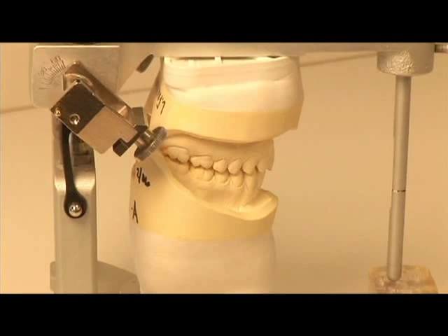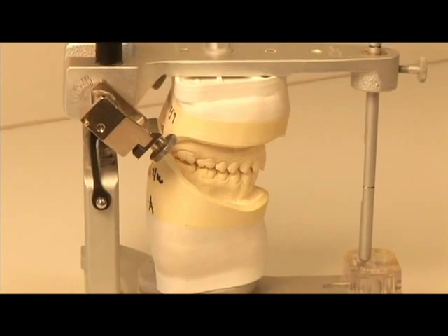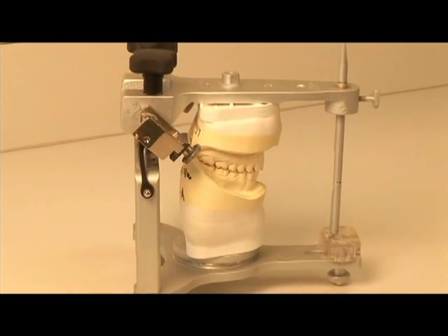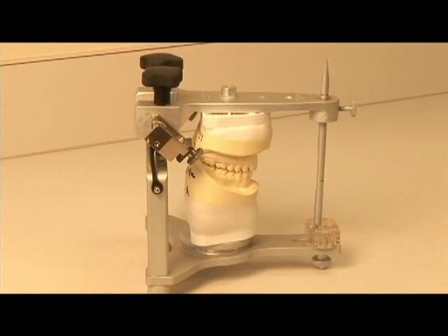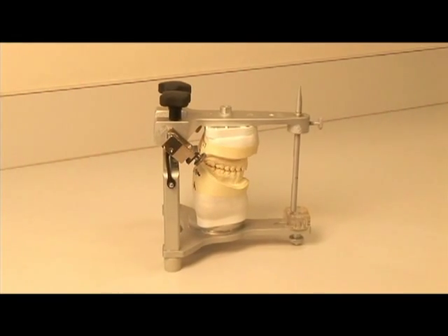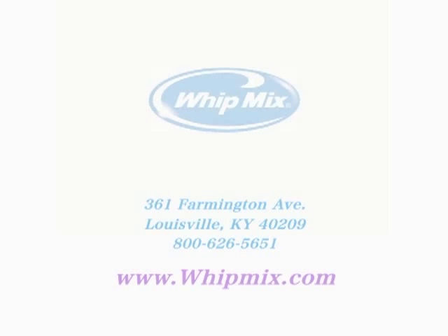The use of the dental articulator truly can enhance your practice. From patient education and case acceptance to analyzing the occlusal scheme and constructing more predictable dental restorations, the articulator provides a valuable adjunct to your clinical practice.